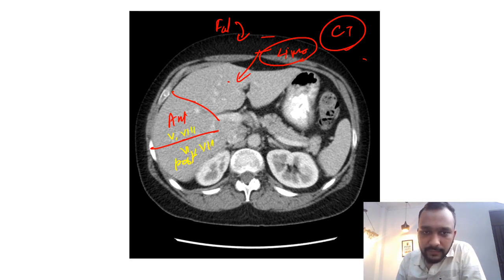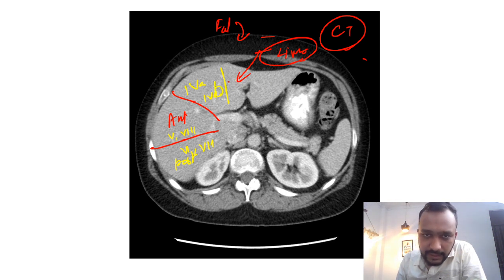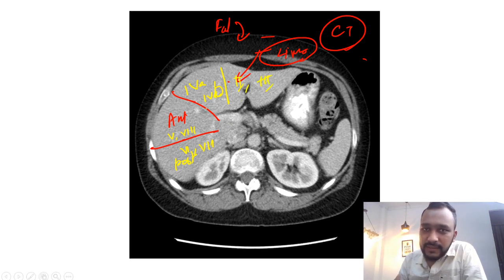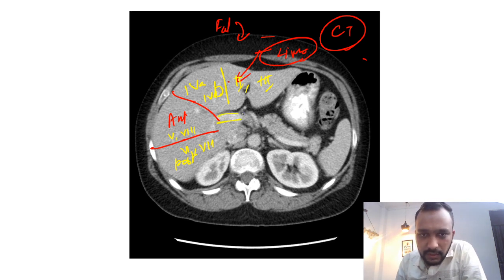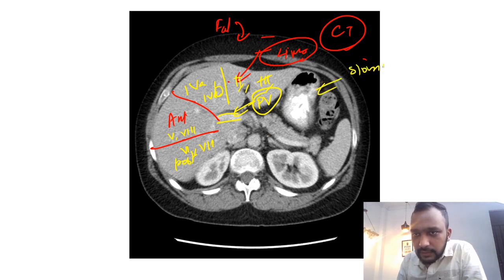The left hepatic vein divides the liver into segment 4a and segment 4b, and laterally you have segments 2 and 3. These segments are further divided into superior and inferior segments by your portal vein.